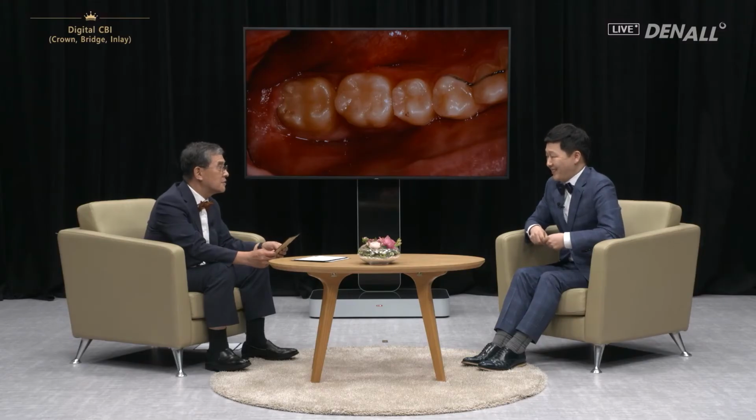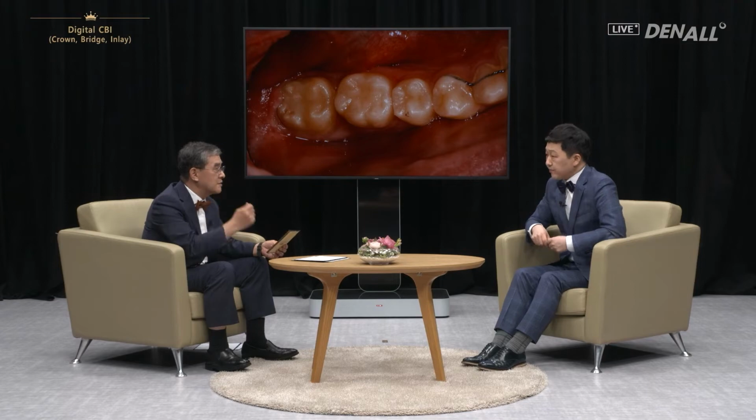Can I ask you a question? Based on my understanding, the materials used for inlay is hybrid resin ceramic and zirconia. If so, what is the wear on the antagonist like regarding these two materials, and which do you prefer more?